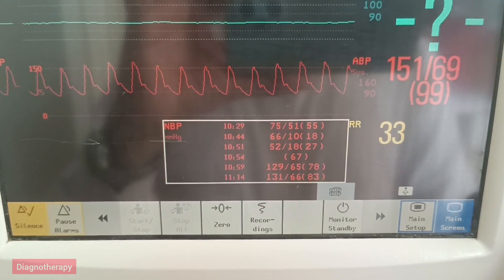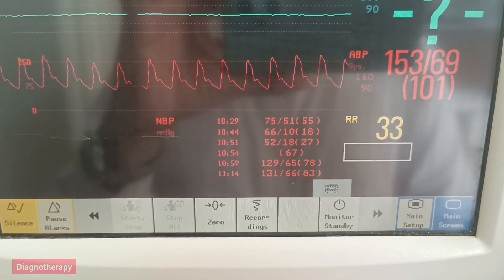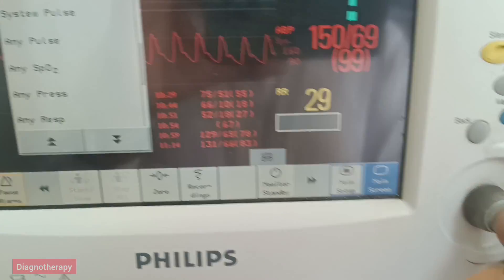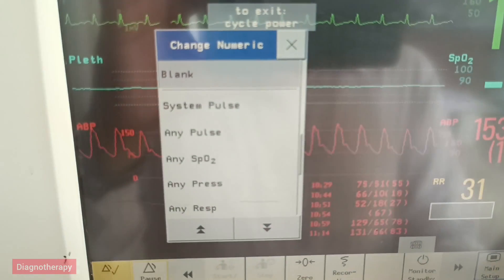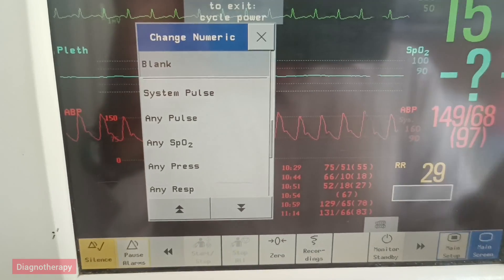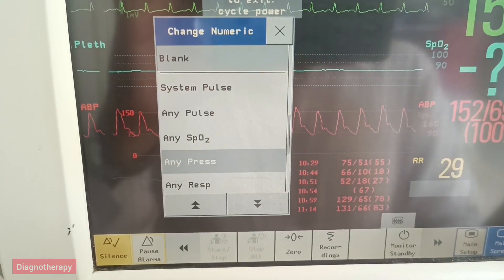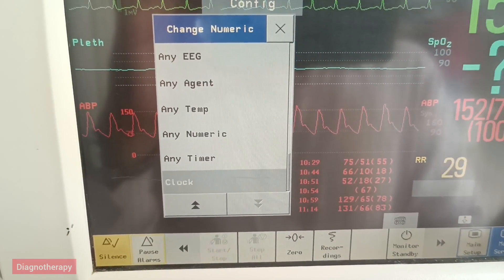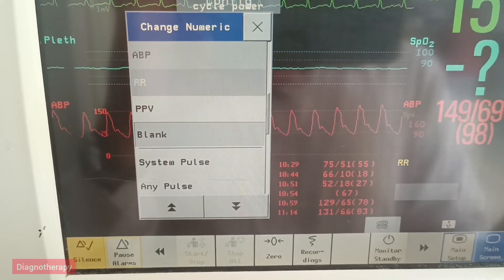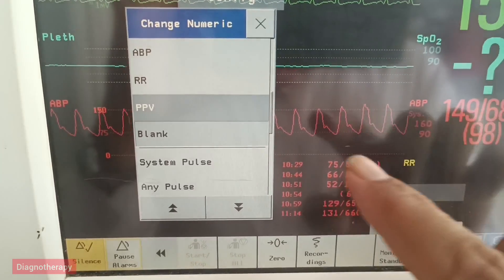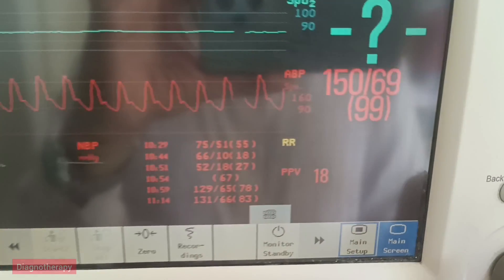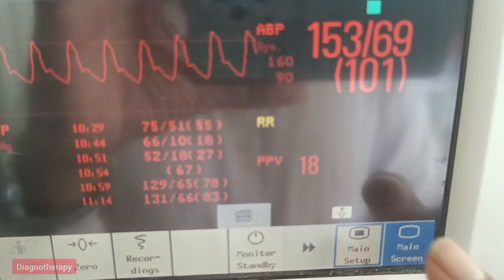Scroll down with the scroller to find a blank space. Press the knob in the free blank space. Scroll up and down to find where PPV is. Here is PPV — just press it. Now you are seeing the pulse pressure variation value on the screen.